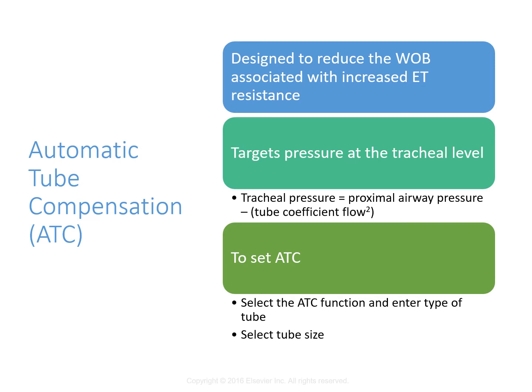But some ventilators allow you to select both the inspiratory and expiratory automatic tube compensation also. So expiratory tube compensation, it's a hard thing to look at here because it can cause premature closure of really unstable airways, so patients with COPD. So we don't know whether it eliminates dynamic hyperinflation or auto air trapping, right? But we'll need more studies to look at that issue. But traditionally, we're looking at inspiratory.